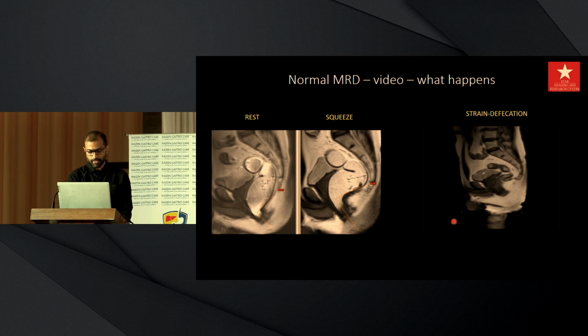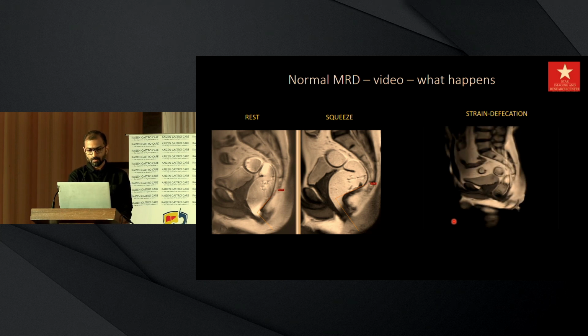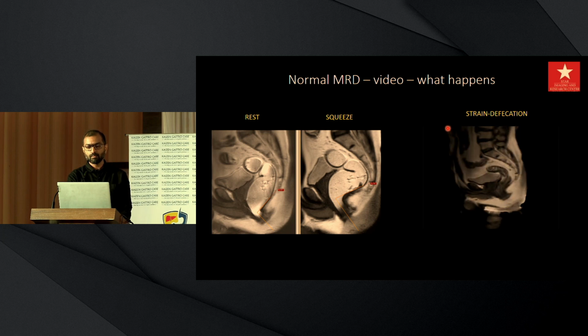What you also see, okay, just look at the movement of the anterior abdominal wall. It basically means that the patient is making a good effort.